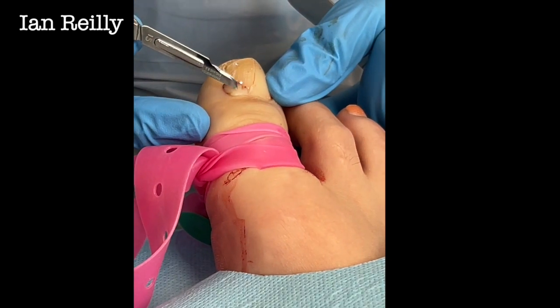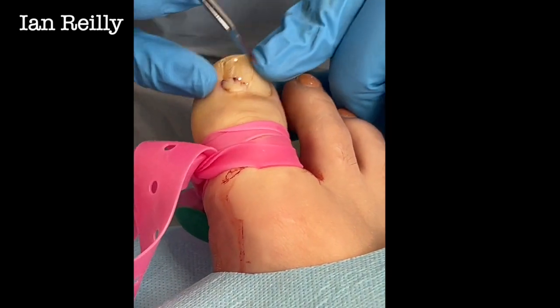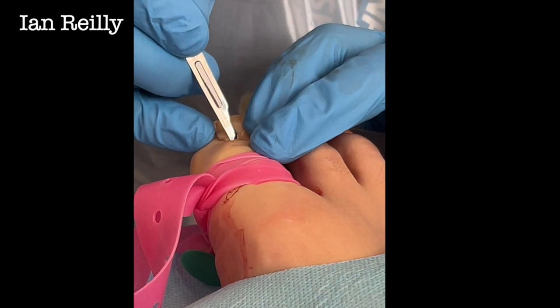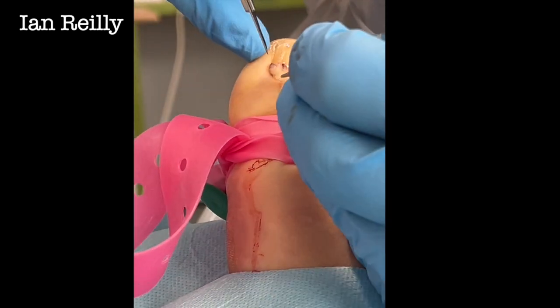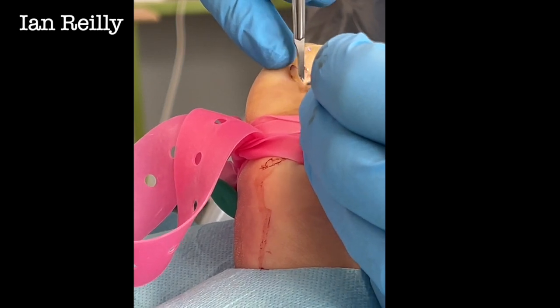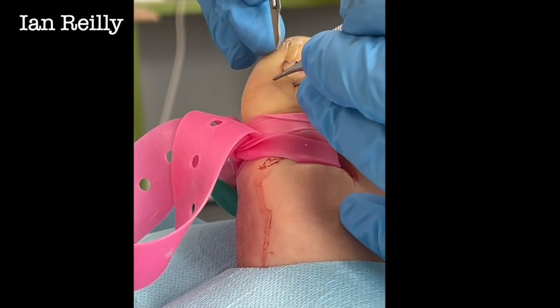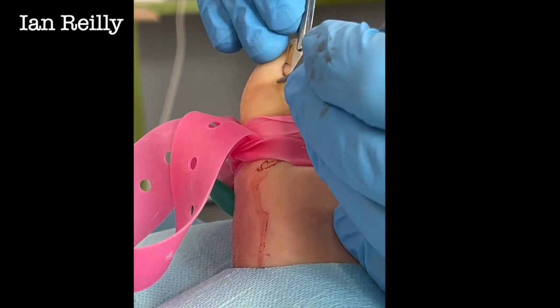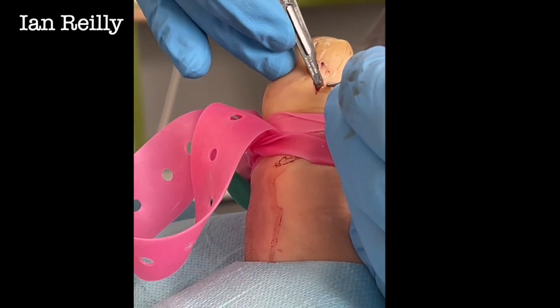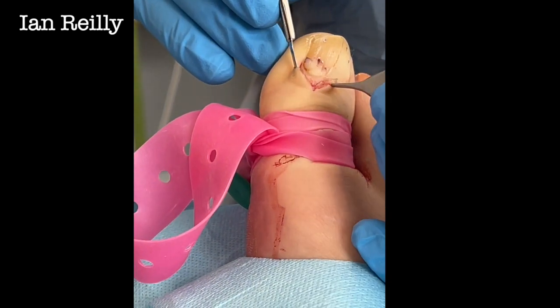So here is our trigger, all nice and white now. I'm going to come on top of the toe — that was a little delicate there, a little too delicate. When you do these, you're never quite sure how much nail trauma you've got. There are times when I've done these where I've actually done a Winograd-type resection of the nail as well.